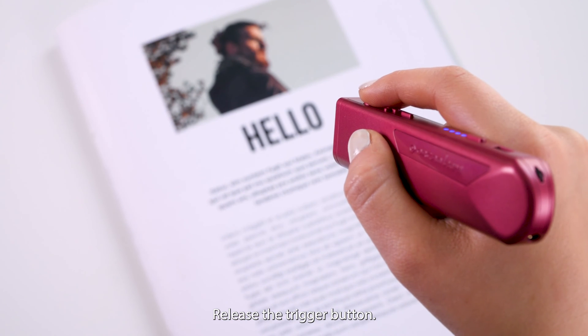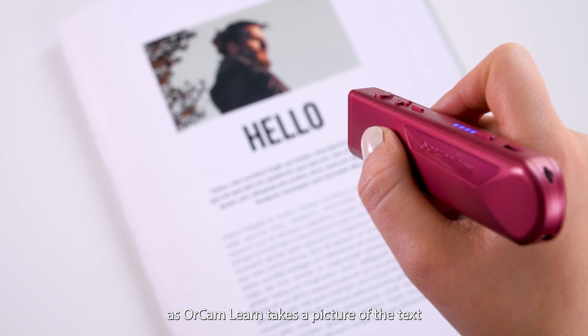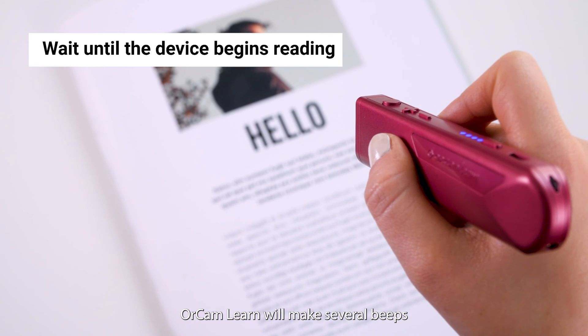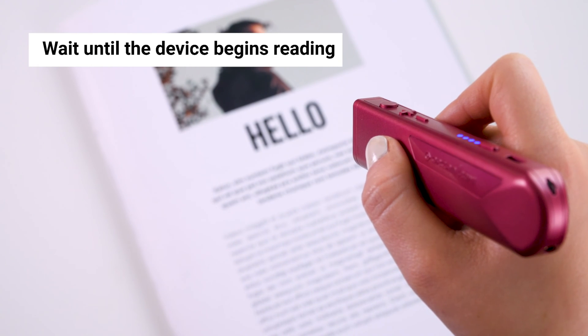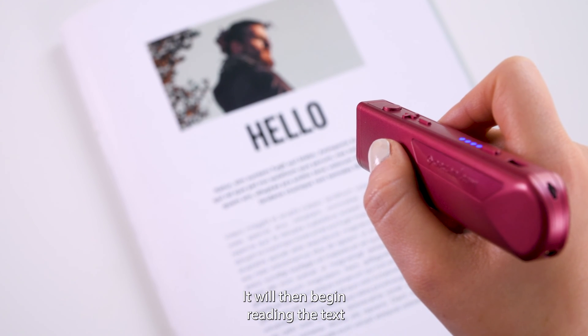Release the trigger button. You will hear a camera shutter sound. OrCamLearn takes a picture of the text. OrCamLearn will make several beats as it processes the text image. It will then begin to read the text.